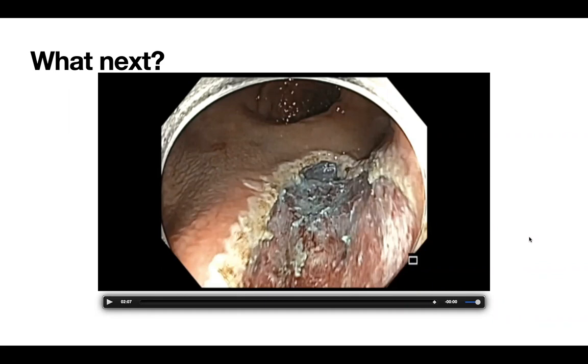tells me that it's not a comment. It's a reality of the situation. No matter who it is, it is important for us to tell ourselves, did I do those 1, 2, 3, 4, 5, 6, 7? With being an expert that he is, he is able to get away with all this without any issues. But for lesser mortals like us, I think we still have to do a retroversion to define the lesion and then proceed with what was done. That would increase my comfort levels in terms of defining the dentate line and hemorrhoids versus what the lesion is. And if it is close to hemorrhoids, I just try to stay away from it.